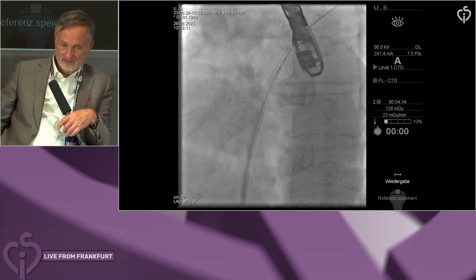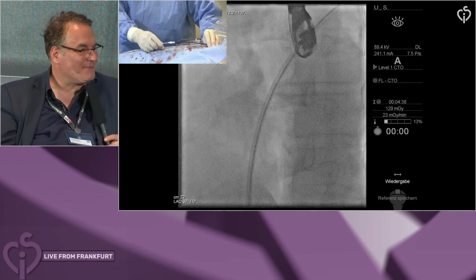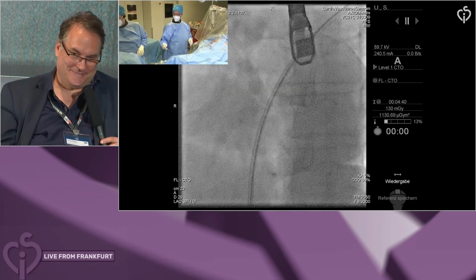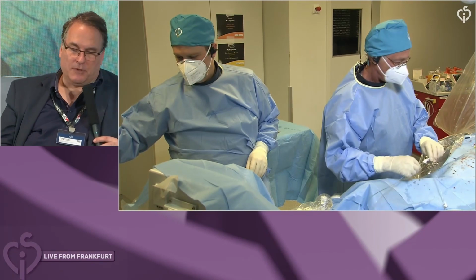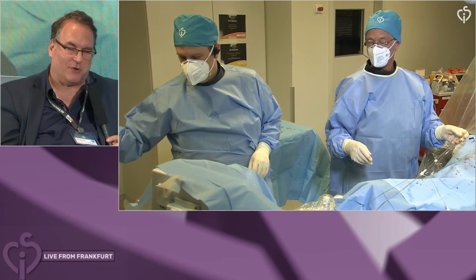Den 25er. And adults, 18 millimeter is small. So do you find yourself using 25 more often or 30 when you use a PFO device? Absolutely 25. I think this is 80%. Or Horst, do you agree?